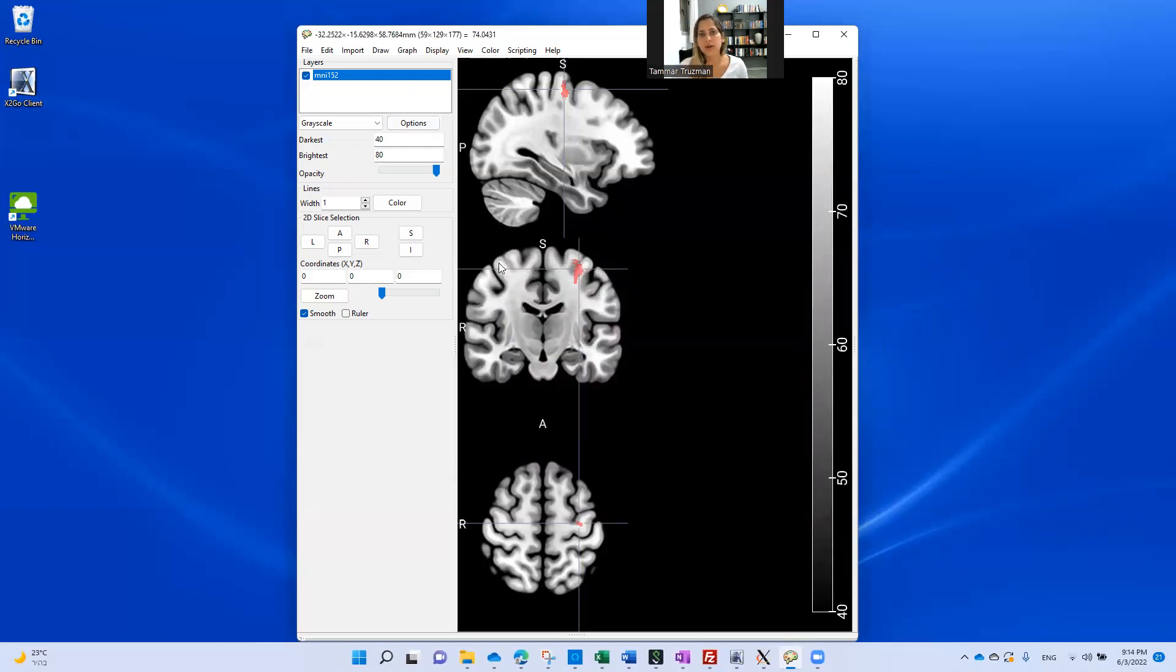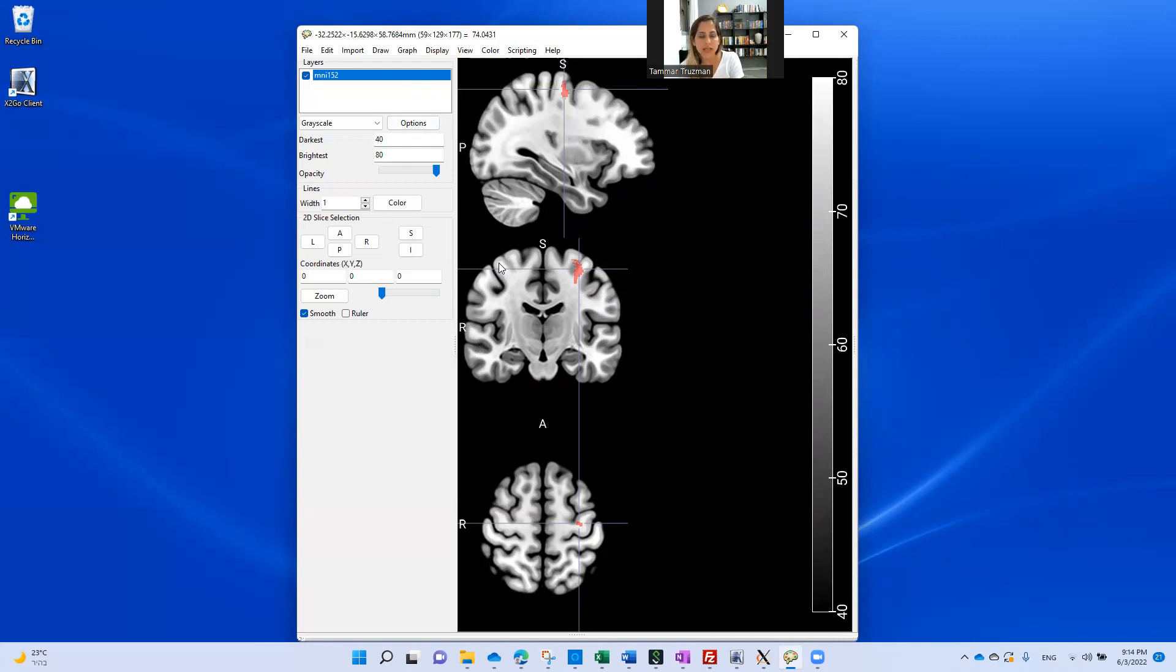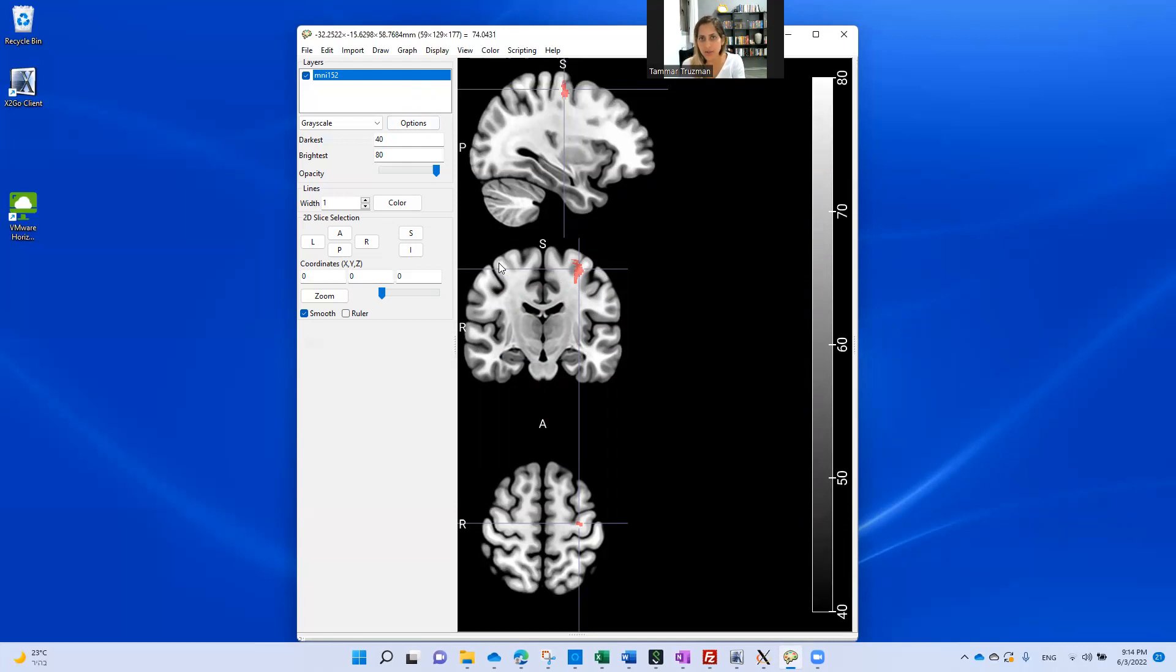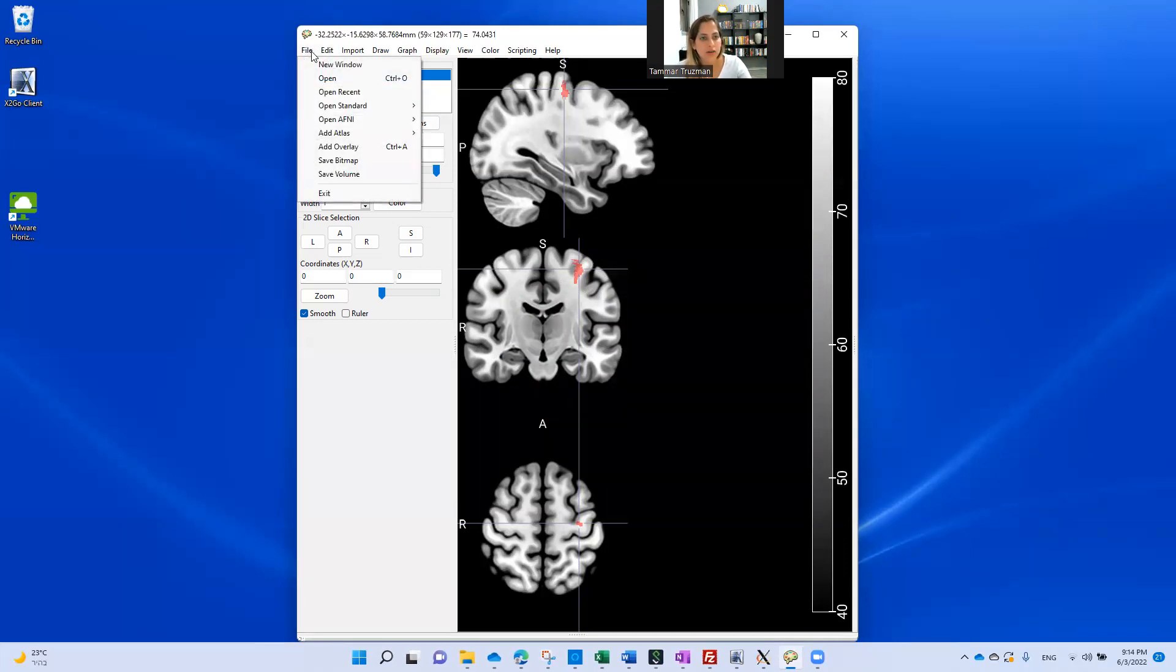Now if I want to know how much my VOI overlaps with anatomical regions, I can load some atlas. I use, for example, the AAL atlas, and I can check how much is overlapping in voxel numbers, in volume cubic centimeters, and in percentage. To do this, I go here, file, go to add atlas. Now I hold the control key button down, because if I will not, then I only will get ROI numbers, but not labels. I'm interested in labels.